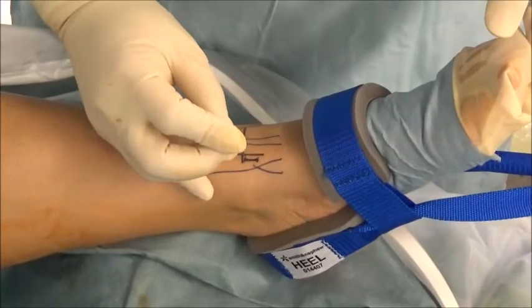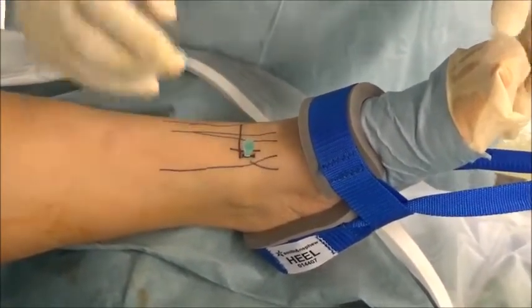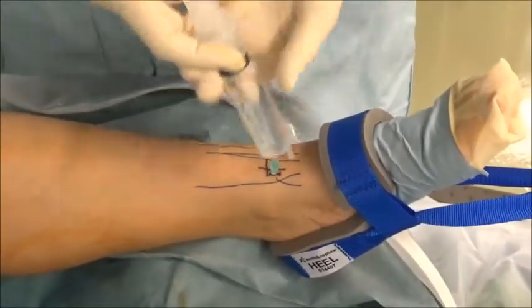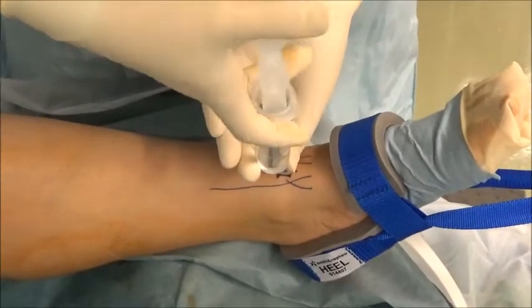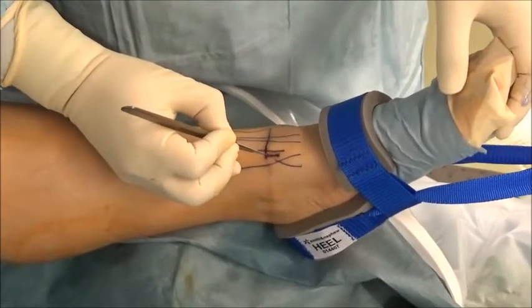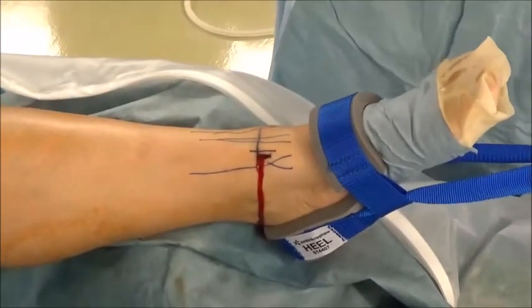Avoiding the marked vein, a 23-gauge needle is used to pierce into the ankle joint and the point of anterior medial portal is confirmed. Thereafter, a skin incision of the anterior medial portal is made with the scalpel.